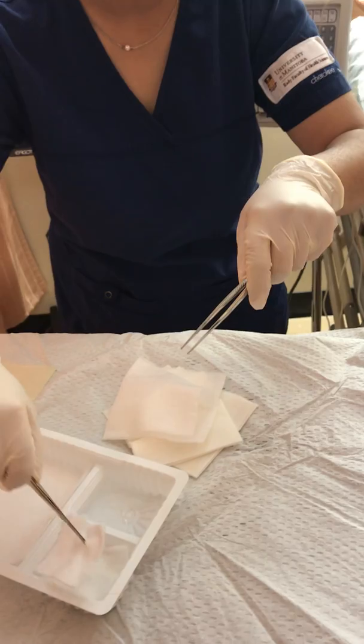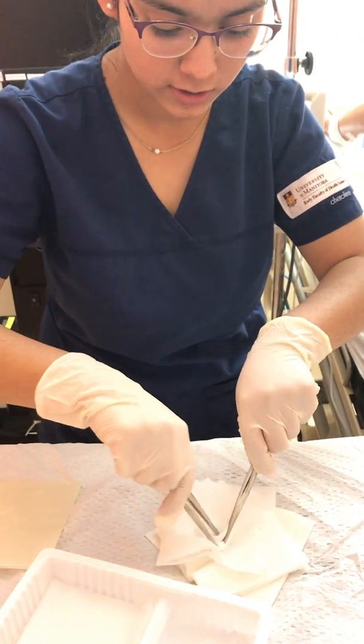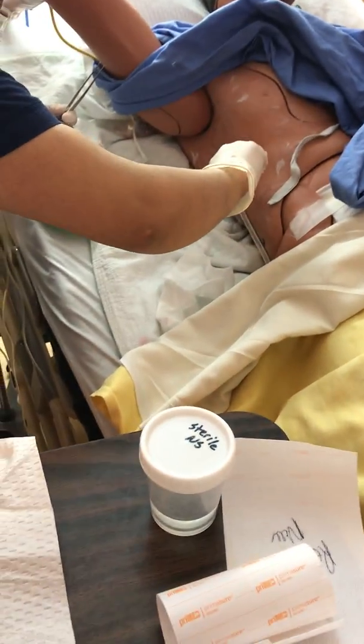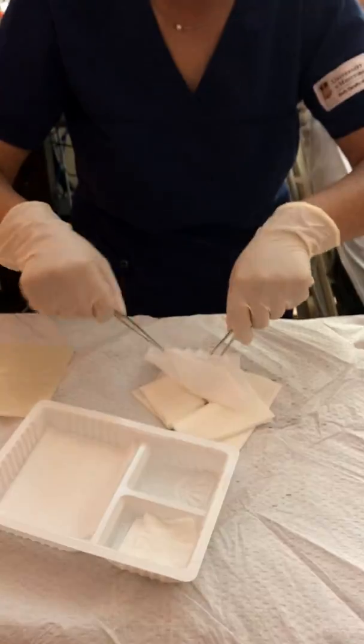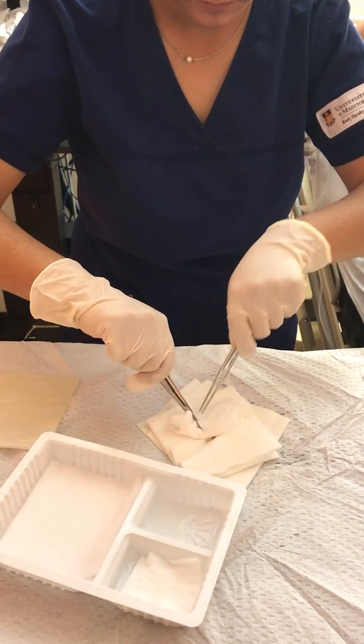I'm also going to make sure that I clean my tubing. So let's just clean that as well before I dry. Dip it in normal saline, get rid of the water, and just clean my tubing. Second garbage. And I'm going to take my clean gloves. Totally occlusive.